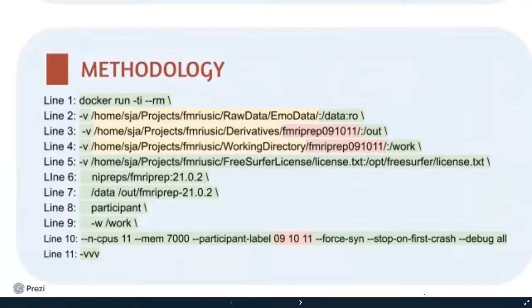Firstly, the newly acquired data was preprocessed using neuroimaging tools such as fMRIPrep and FSL. fMRIPrep runs basic preprocessing steps. We then used FSL to run ICA-AROMA. ICA-AROMA is a method that identifies and removes any motion-related independent components from fMRI data. ICA, or independent component analysis, is a signal processing method to separate independent sources that coincide with each other. AROMA stands for the automatic removal of motion artifacts and removes ICA components from our fMRI data.